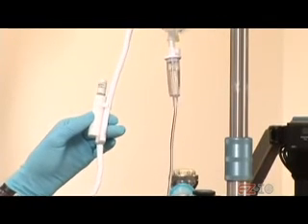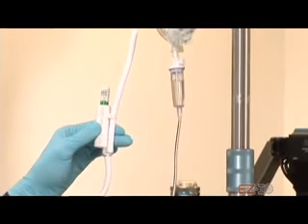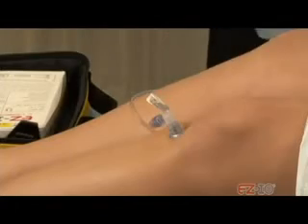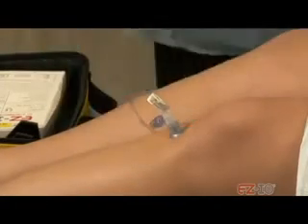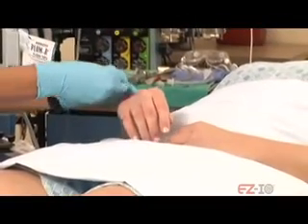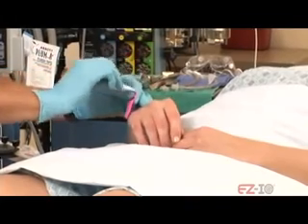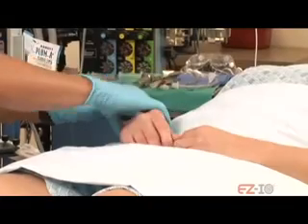Still a 1? Mm-hmm. Okay. All right, I'm just going to check that and make sure I don't have any fluid leaking around it. Great. Now the last thing is just to put the wristband on. This just lets everyone else in the hospital know that you've got an IO in place. All right, there you go. You did great.